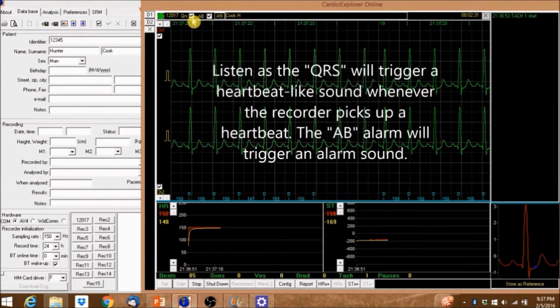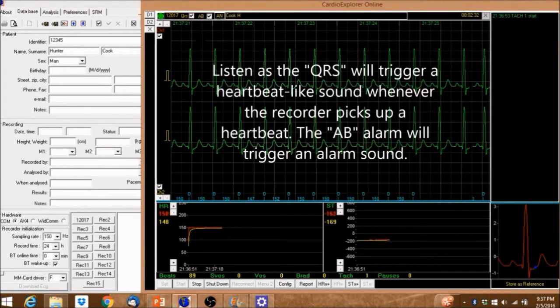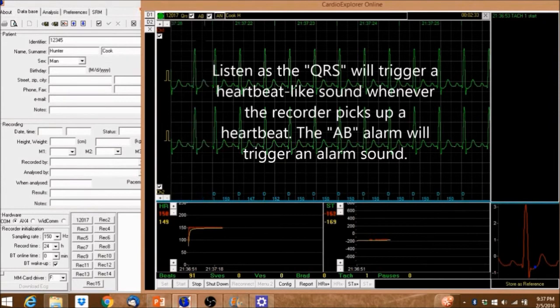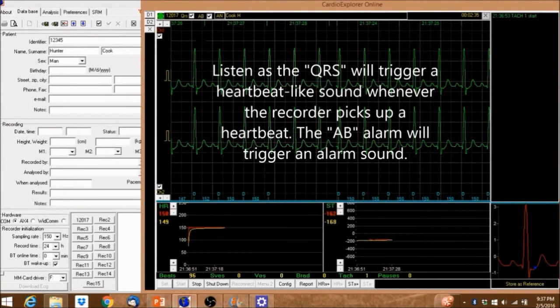Listen as the QRS will trigger a heartbeat-like sound whenever the recorder picks up a heartbeat and the AB alarm will trigger an alarm sound.